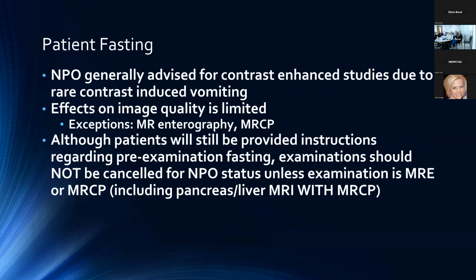One other quick thing that I wanted to mention is patient fasting status. Generally, obviously, we recommend that all patients be NPO for any contrast enhanced study, mostly due to the potential rare contrast induced vomiting and trying to avoid any aspiration with regards to that. But with regards to effects on image quality, really not much of a concern.